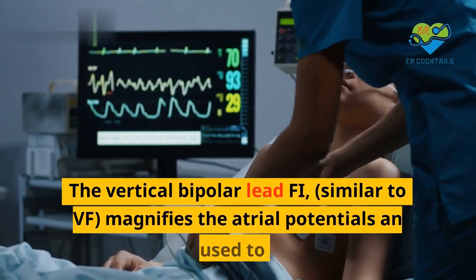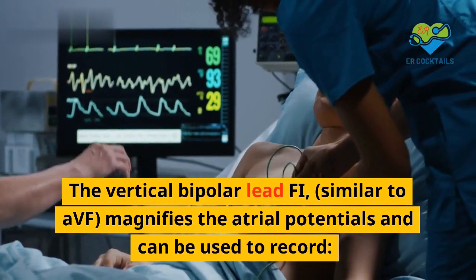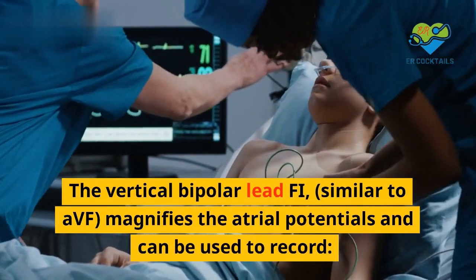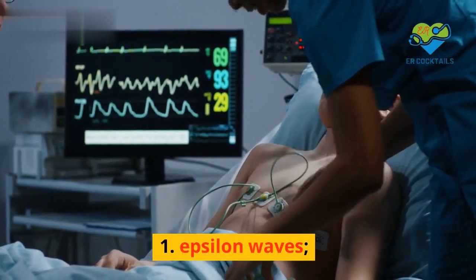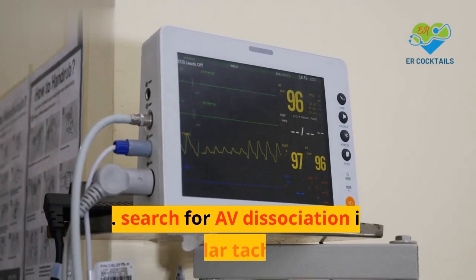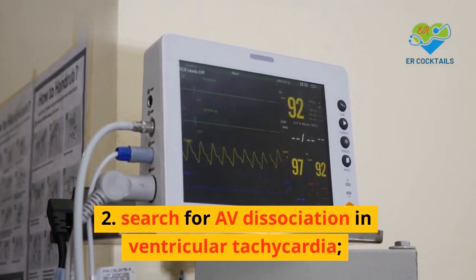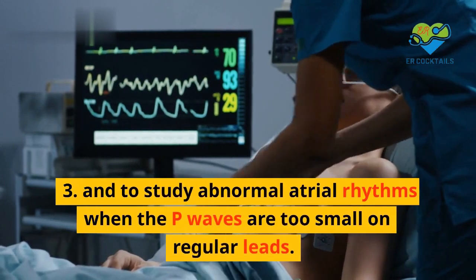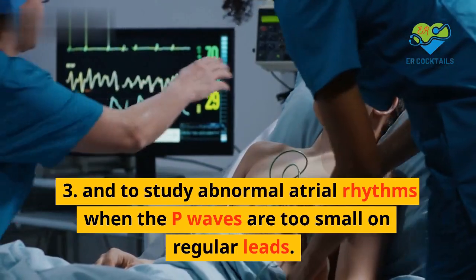The vertical bipolar lead FI, similar to aVF, magnifies the atrial potentials and can be used to record: 1. Epsilon waves. 2. Search for AV dissociation in ventricular tachycardia. 3. And to study abnormal atrial rhythms when the P waves are too small on regular leads.